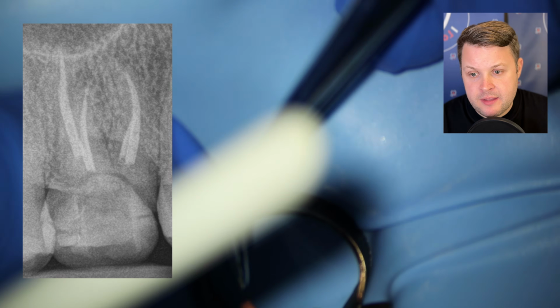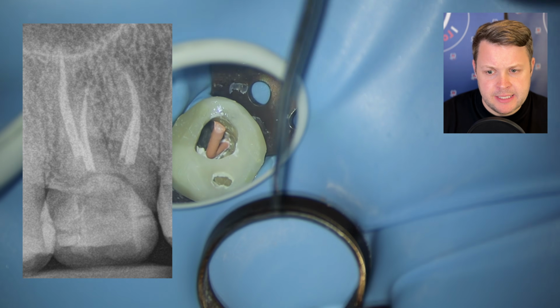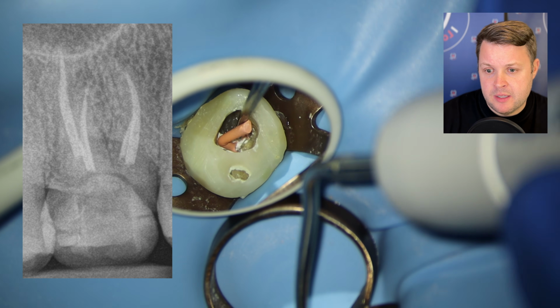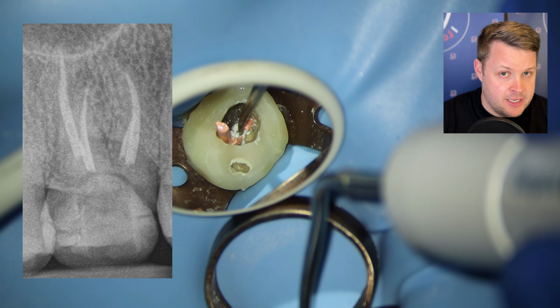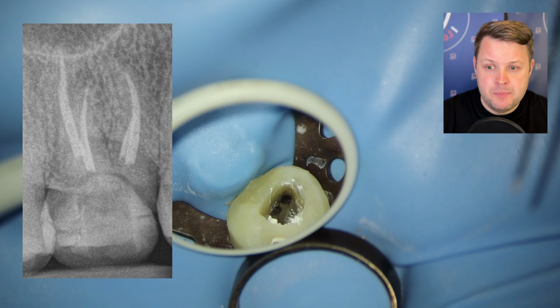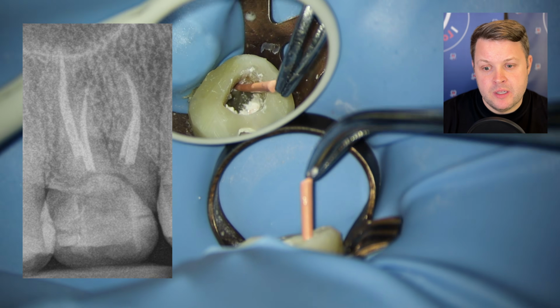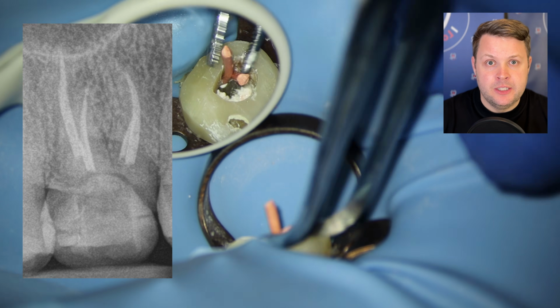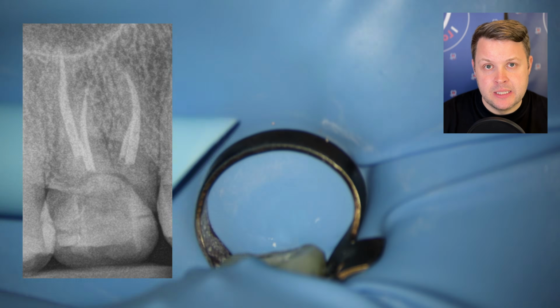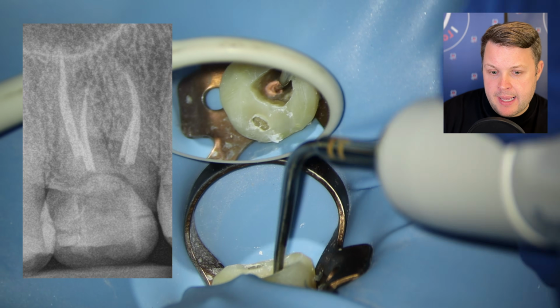And then when we look at the post-op radiograph, I'm really, really happy with this. It looks really, really nice. As before, we can see that all of the obturation is within the acceptable level of the radiographic apex, which is between 0 and 2 or 3 millimeters. If we draw our attention to the palatal canal, there's an argument to say maybe there's been a little bit of extrusion of sealer there, and possibly by pushing quite firmly down and using lots and lots of bioceramic, we've managed to seal that seemingly non-patent canal. But it's hard to say. Overall, I'm quite happy with this.